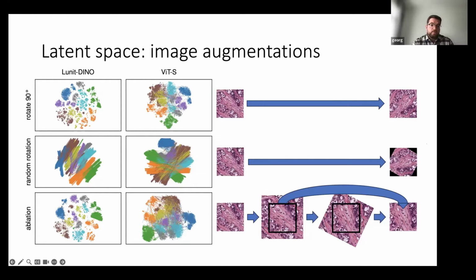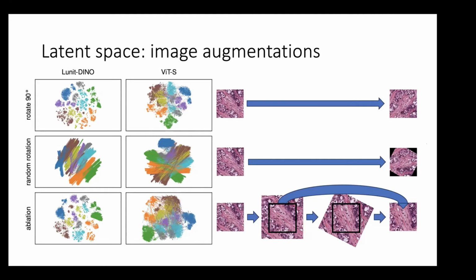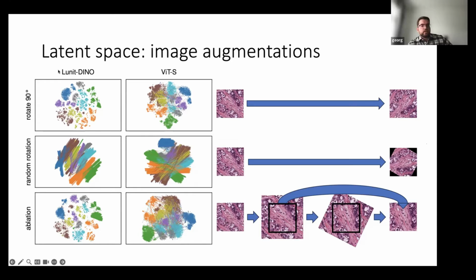Actually, one interesting thing which I will go into at the end is that this feature extractor performs pathology-specific augmentations in the SSL pre-training. So they really chose specific augmentations for, like, rotation to ensure that the feature extractor is more robust to, for example, rotation and other augmentations.